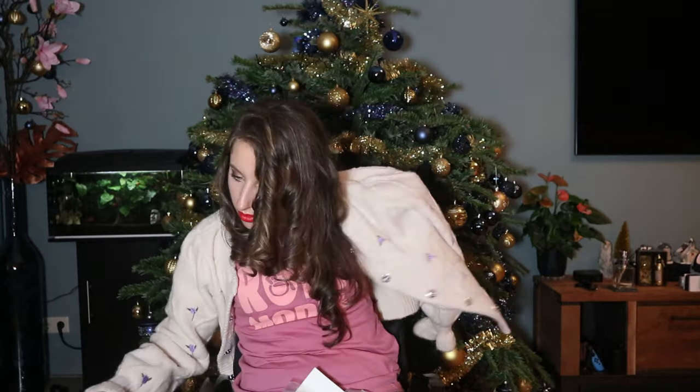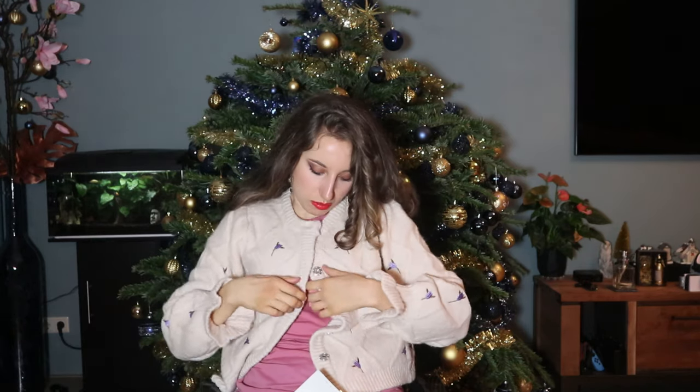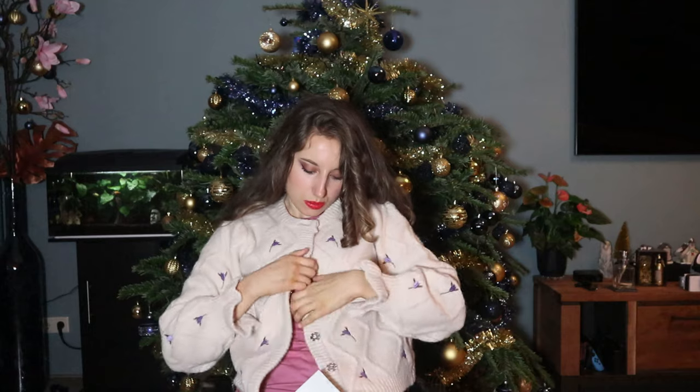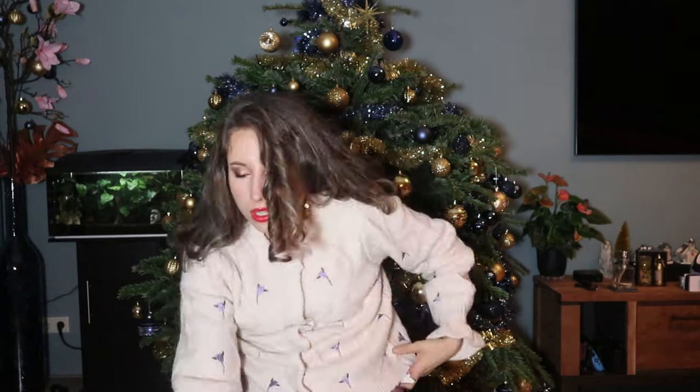It looks like this, and I'm having this one here with me — I'm gonna take it off. So this one has only one button, because the rest are like this. And so I'm gonna do the others quickly.